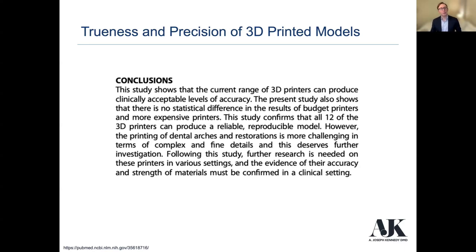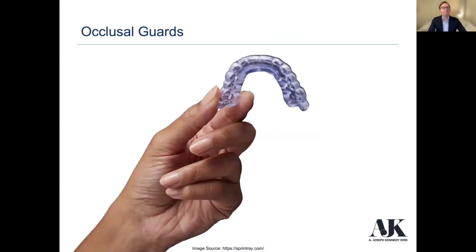And what I mean by that is if you look at a lot of the things like surgical guides, which is even temporarily used in a patient, we'll say, but conversely, something like a definitive crown, which some people are using. We want to make sure that these are coming from reputable sources and you're not just using a budget resin because it's less expensive. Want to make sure that it's gone through the studies to make sure that that's a viable option for patient use. So what are some of the other things that we're doing?